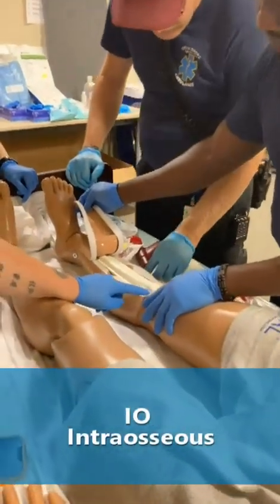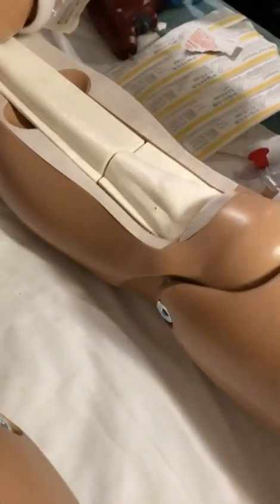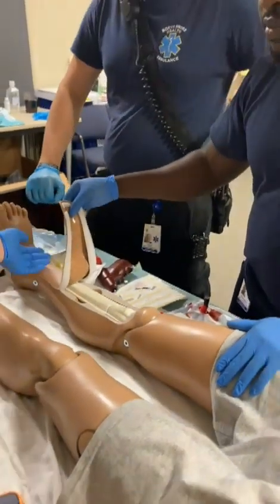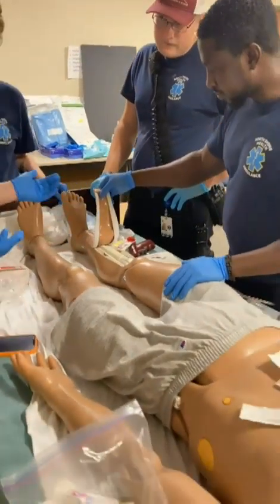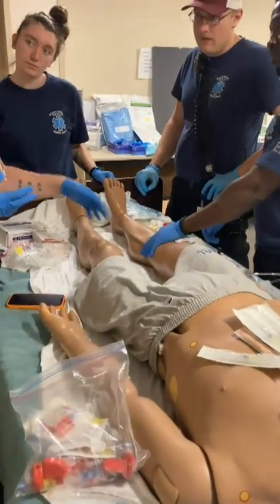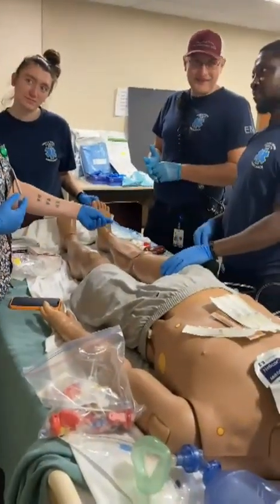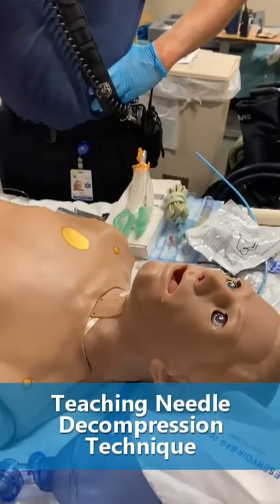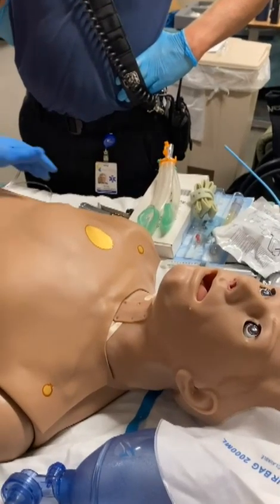Good job, yes, that's really great. So we're looking at two right here — wonderful. You felt the give; I get that the drill kind of sucks, but you felt the give. You can feel that resistance, and that's exactly what you're going to feel. If they're not sedated and they have issues or they're awake, it's a scream you'll always remember, because as soon as you push that flush in, that's what's painful sometimes doing the IO.